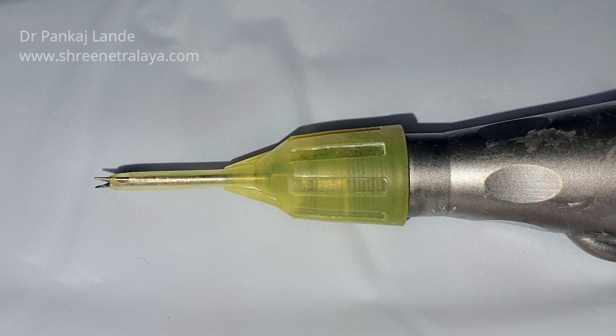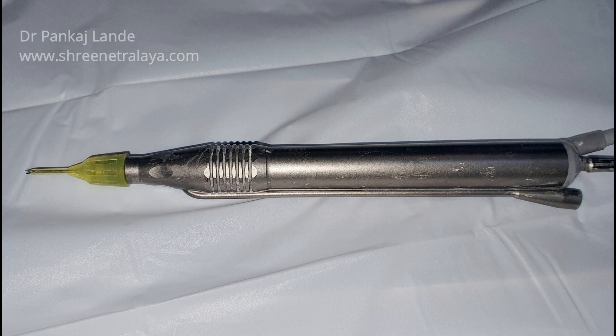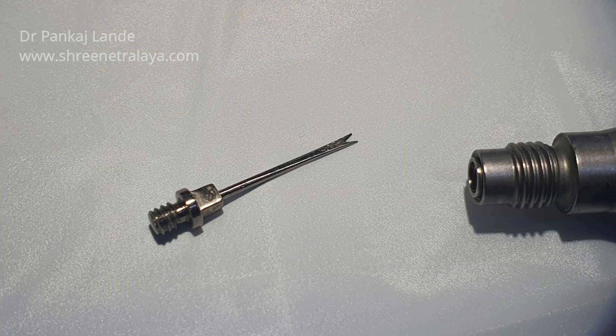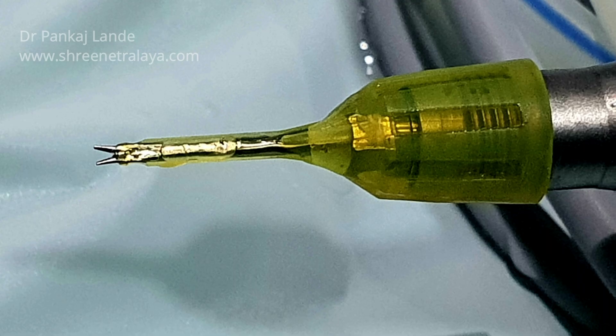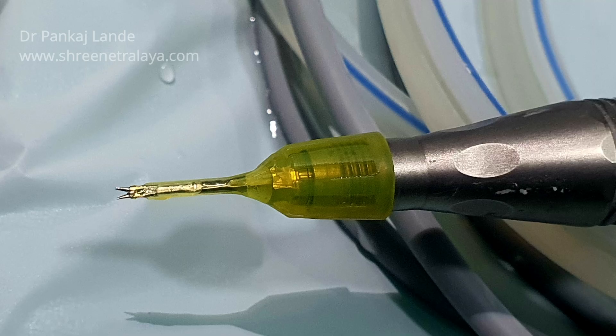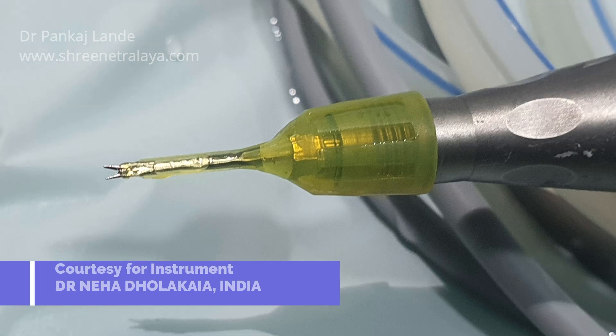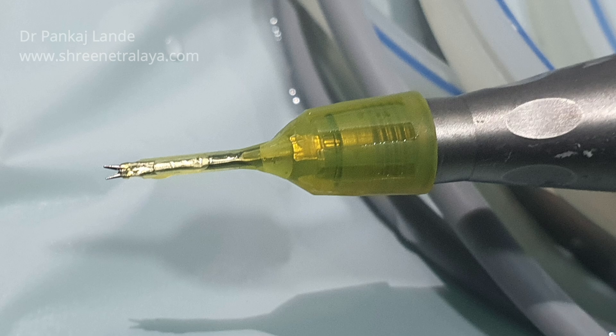Hello friends, here is a detailed video of how to use an ultrasonic pre-chopper in hard cataracts. This is a tip introduced as an IOL cutter by Dr. Neha Dholakia, and it has a cutting edge at the V groove in the distal end. This tip can be attached to any FACO machine and used as an ultrasonic pre-chopper. This tip is like a FACO tip but it does not have any bore.